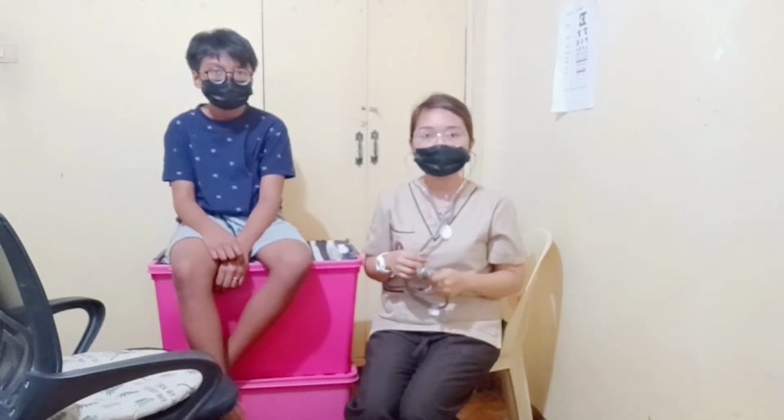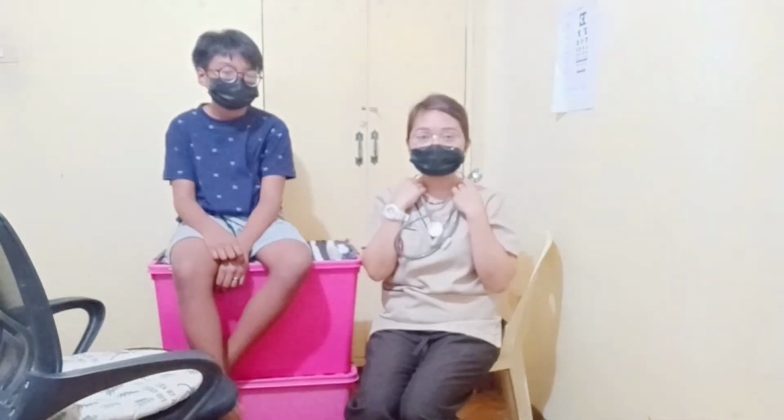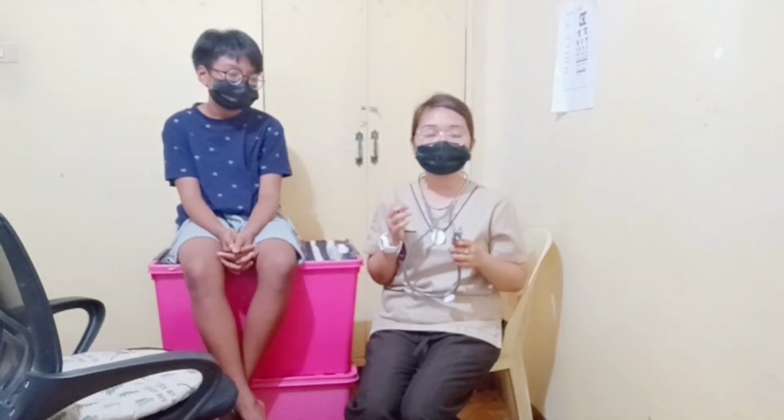And then after that, we also have to make sure that we place the diaphragm on the apical pulse of the patient. Okay. So we listen for the S1 and the S2. So by the way, the S1 is the lub, and the S2 is the dub sound. The S1 is the lub sound or the first sound that you can hear, and the S2 is the second or the last sound that you can hear. Now in the apex part of the heart, normally the S1 is more dominant, or can be heard better.